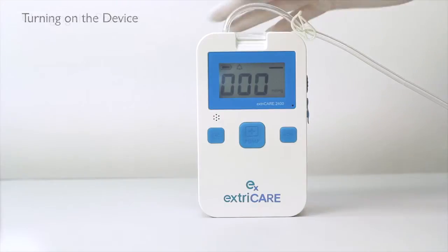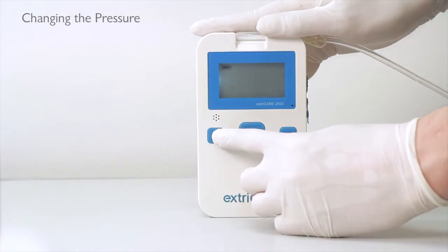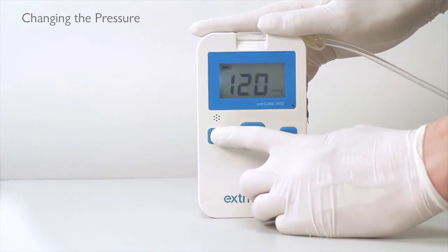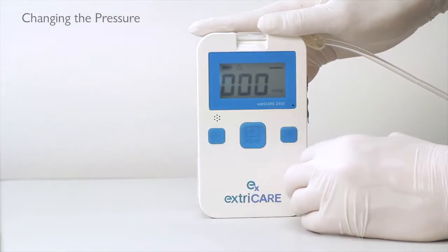To set the pressure, hold down the SET button until you hear a beep. You will see a blinking number. To adjust the pressure, press the SET button. The pressure can range from 40 mmHg to 140 mmHg. Once it cycles to the prescribed pressure, press the PUMP button to confirm.